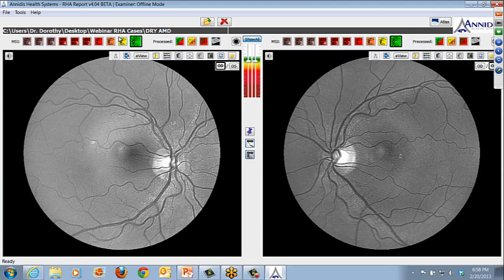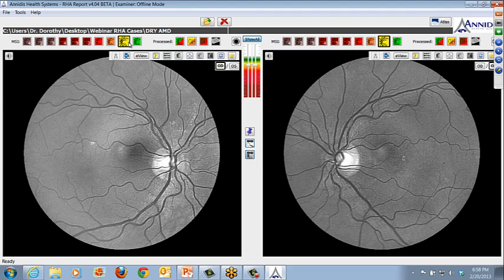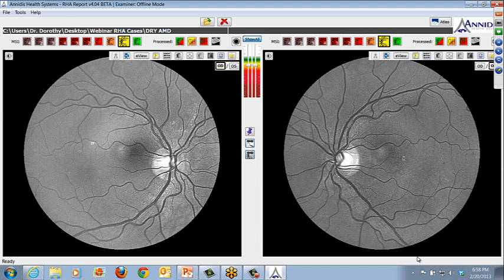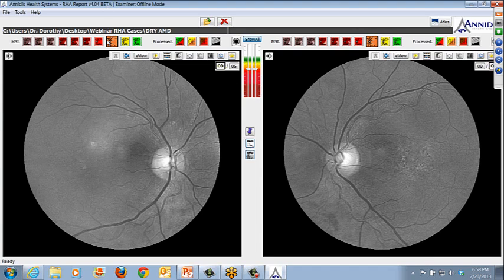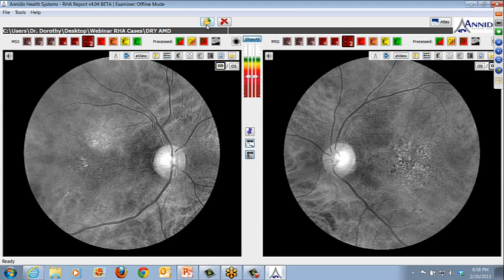Now I'm going to show you how to toggle back and forth and look for drusen. In this particular case, there's a relative lack of drusen. There might be a couple of places here on the yellow, excuse me, amber that show small patchy areas of drusen. And remember, it's the combination of RPE dysplasia and drusen that puts a patient at highest risk. But even a patient with this level of atrophy, which I consider to be significant, you can employ some treatments.